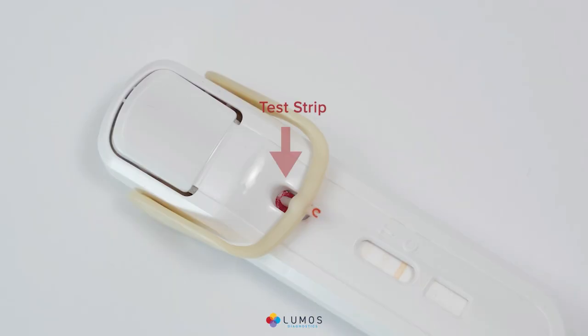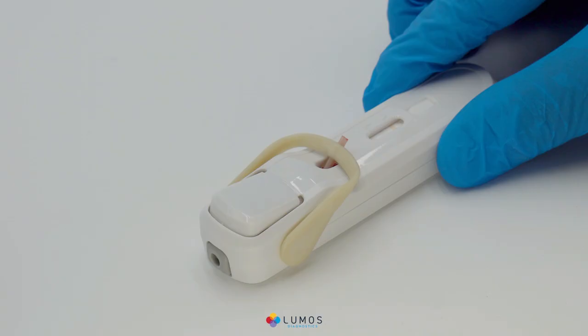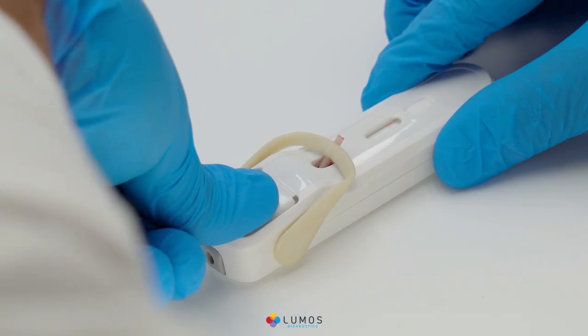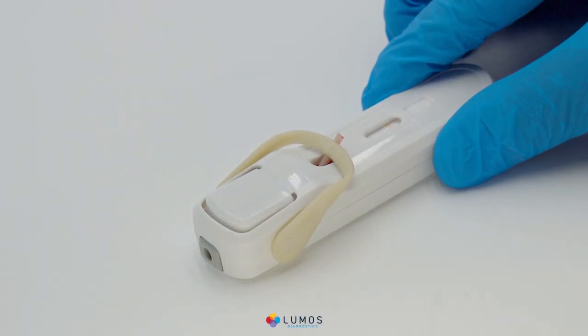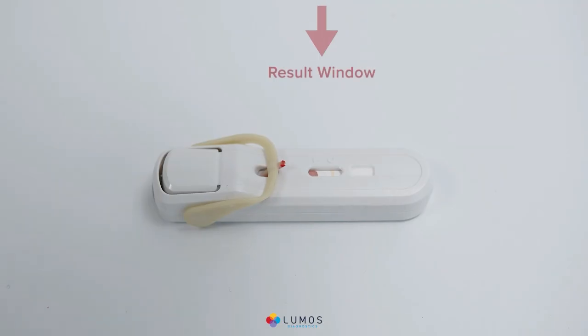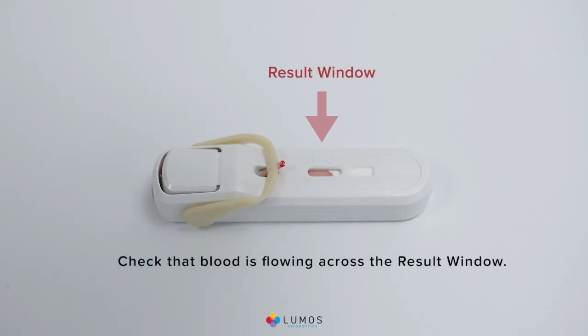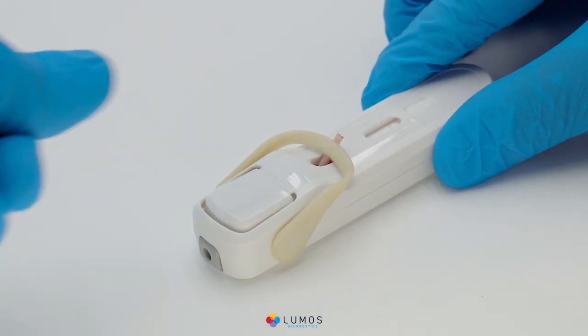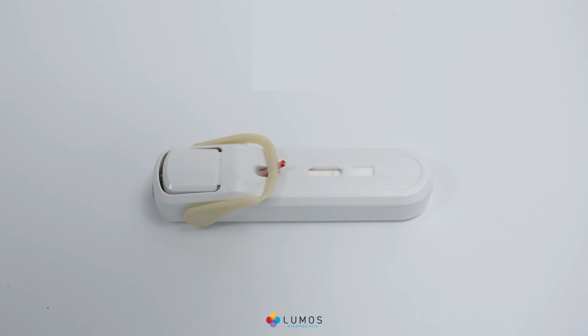Once you see that the blood has transferred, activate the test by firmly pressing the buffer release button until it clicks to deliver the buffer. Make sure the button is completely pushed down. Check that blood is flowing across the result window. If blood is not visible in the result window within 30 seconds, firmly repress the buffer release button until clicking is audible. If blood is still not visible, stop, discard, and retest.